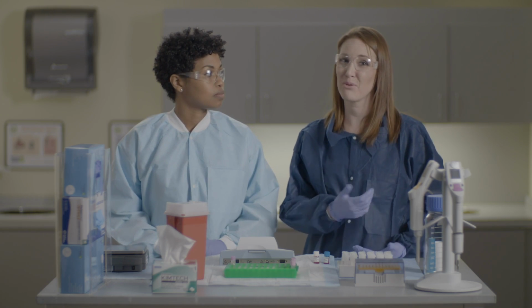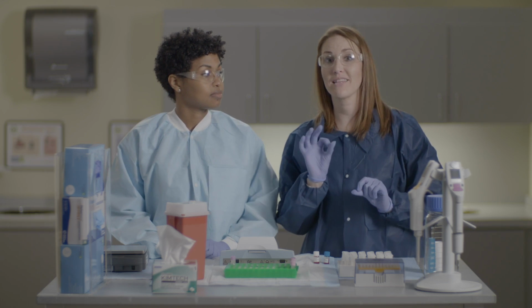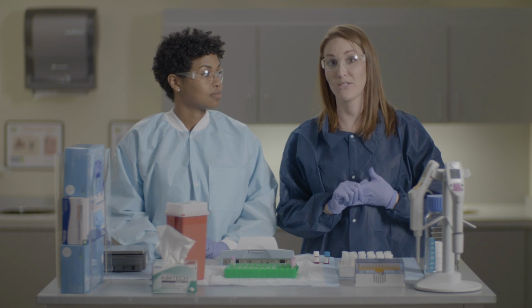Doing every step correctly helps achieve an accurate result. And accurate results mean less anxiety for the patient and parents. You avoid retesting and the costs involved with that. When test results are inaccurate, people lose faith in the test. If healthcare providers lose confidence in blood lead test results, they may be reluctant to test children for lead. Speaking of results, if you do get a result that's at or above the reference level, what's done to confirm those results? A confirmatory test is always done with a venipuncture, not a finger stick. All the precautions are basically the same, and don't forget to always take the lead sample first if you're drawing blood for multiple tests. So let's remember what we just covered.